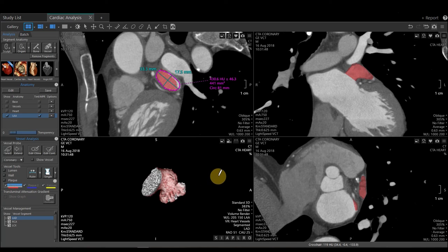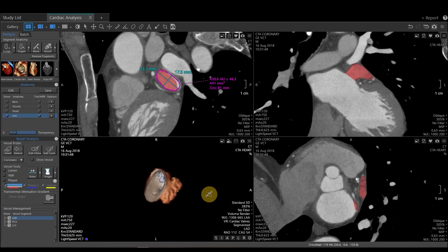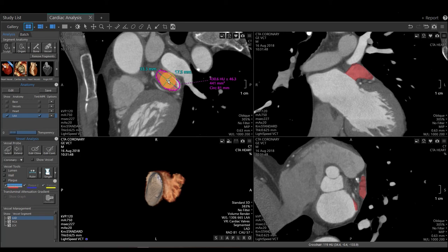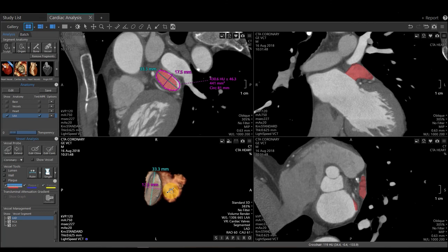One other thing I would like to show is that by using the cardiac analysis application, we can actually see our measurements in the 3D viewport. I'm going to switch this to cardiac valves and turn off the heart. I can rotate this around and see through the ostium here. If I go to my measurement, I can right click and select Show in 3D. If I would like to take a screen capture of that, I'm going to select the camera in the upper right-hand corner.